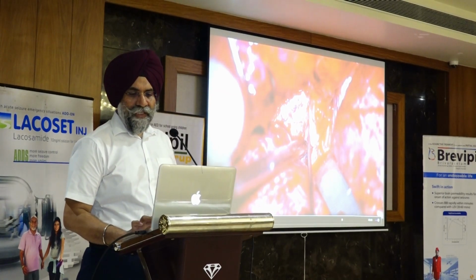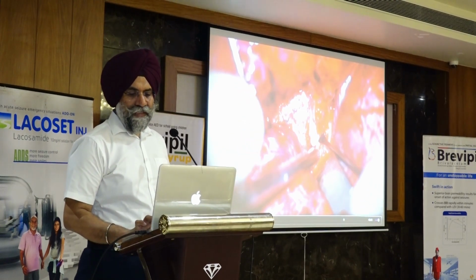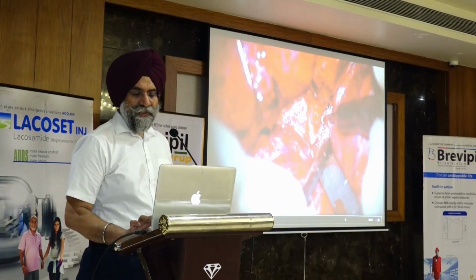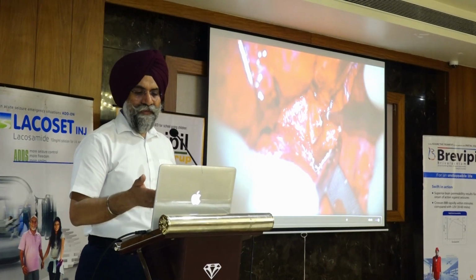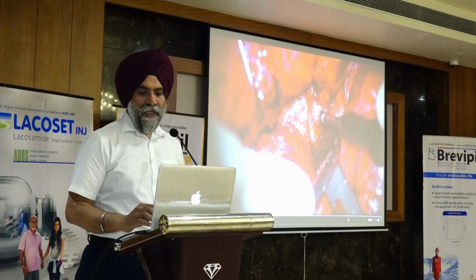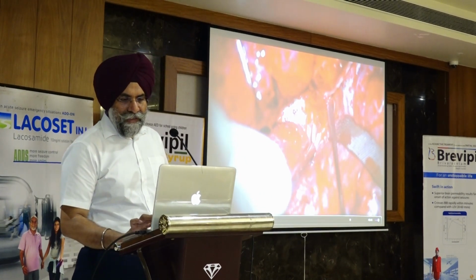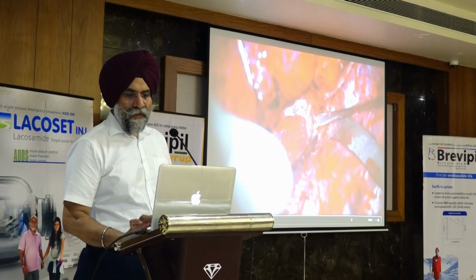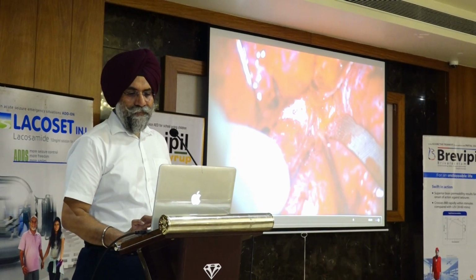Yeah, now this is the anterior clinoid process. So the cavernous sinus lateral wall dissection is almost complete. Now we'll drill the anterior clinoid process. So the clinoidectomy is done. Because it is clearly visible, it is hardly a job. It can be done very quickly with the help of your pneumatic drill. So it is done. This nerve is the third nerve, which is stretched out here. This is the area, and just medial to that there is the optic nerve.